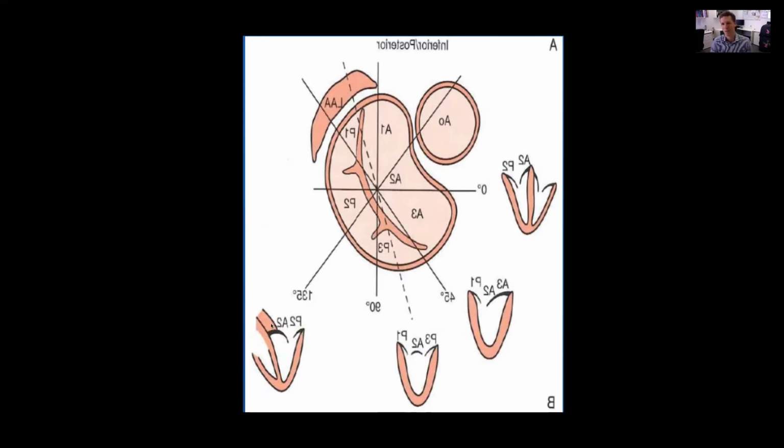Okay? So it's worth practicing and thinking about. Use your hands: left hand, anatomical view; right hand, TOE probe. Keep it flat, that's your 0 degrees, apical 4-chamber view.